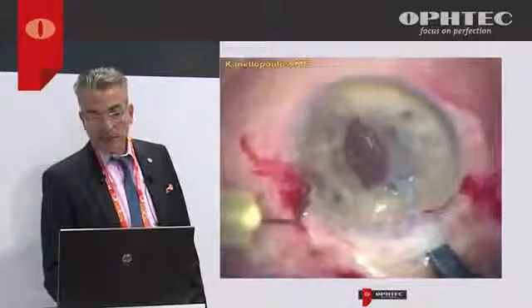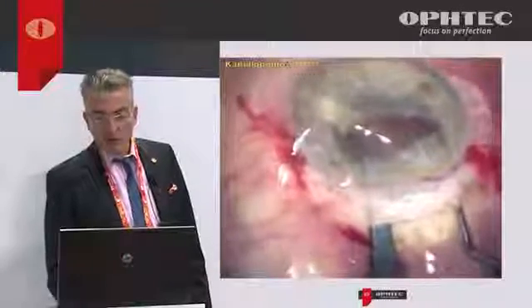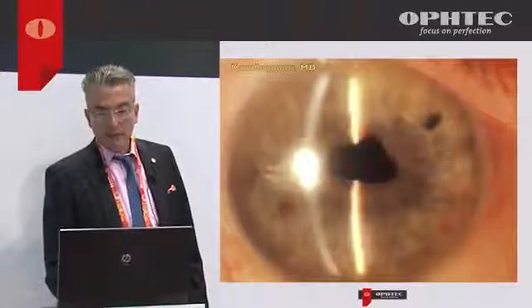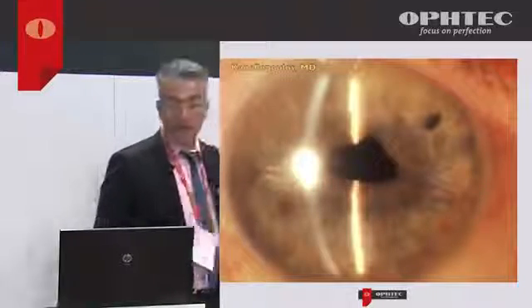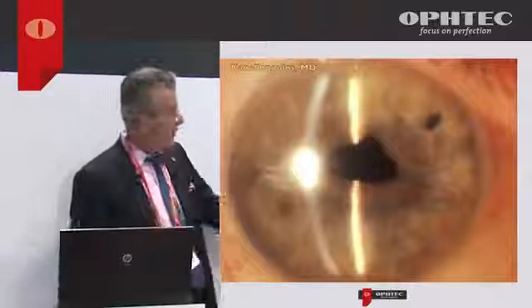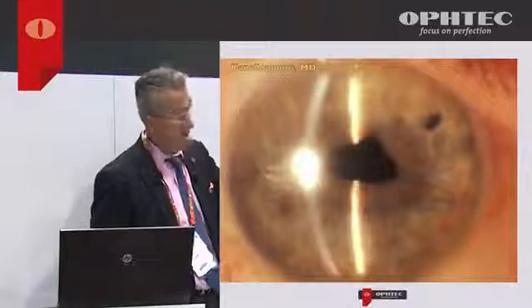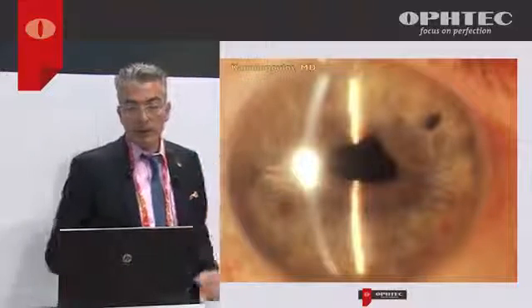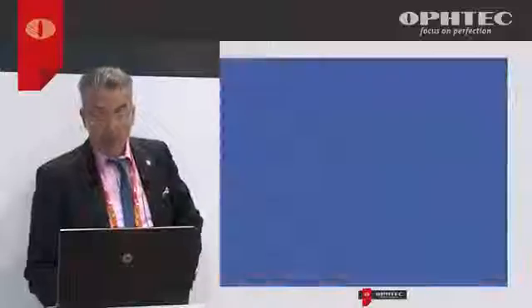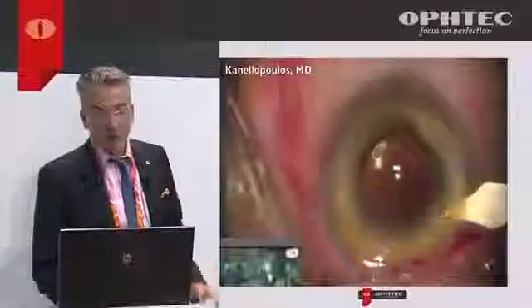So again, same technique. It's almost using triamcinolone to make sure there's no vitreous in the anterior chamber, suture, and this is another result. Small iridectomy, very nice diametrical enclavation. Here, as you can see, I stretched the iris a little bit during the enclavation, and instead of re-enclaving the lens, I just did a little snip pupilloplasty to give a better pupillary aperture to the patient. It doesn't look great, but it's very functional for the patient.